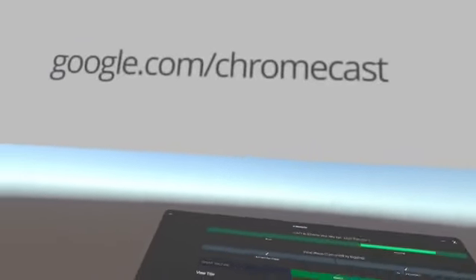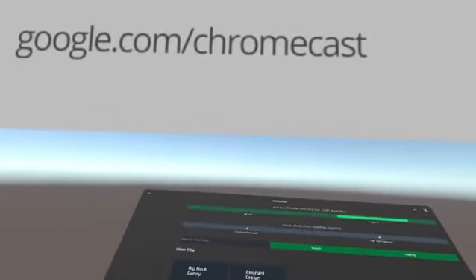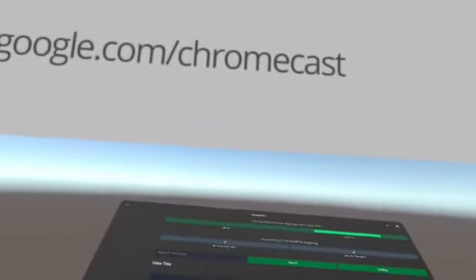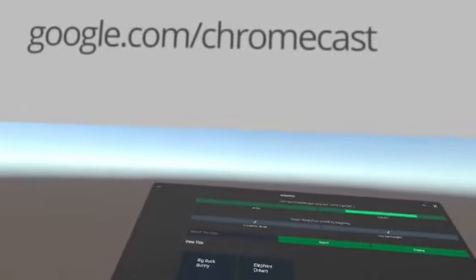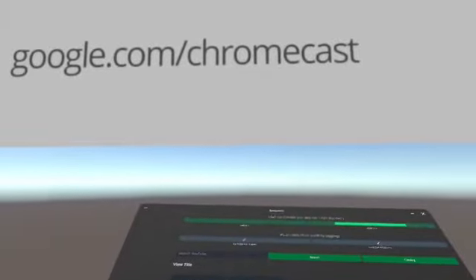So this shading effect is also not part of patching. So patching is either you fully cover or you don't cover anything. So transparency also you can manage here. So this is better than patching in terms of that. In patching, what happens is that your dominant eye just never works together with your lazy eye. Okay, that is the problem. But here you can actually activate your dominant eye also, but to a limited capacity.